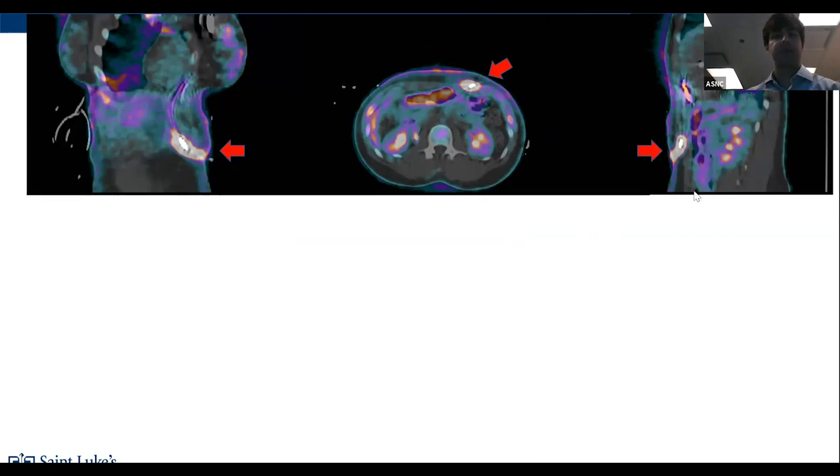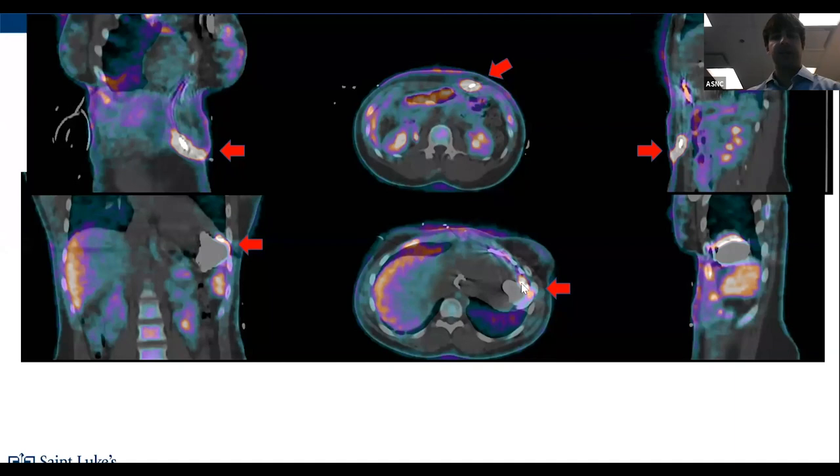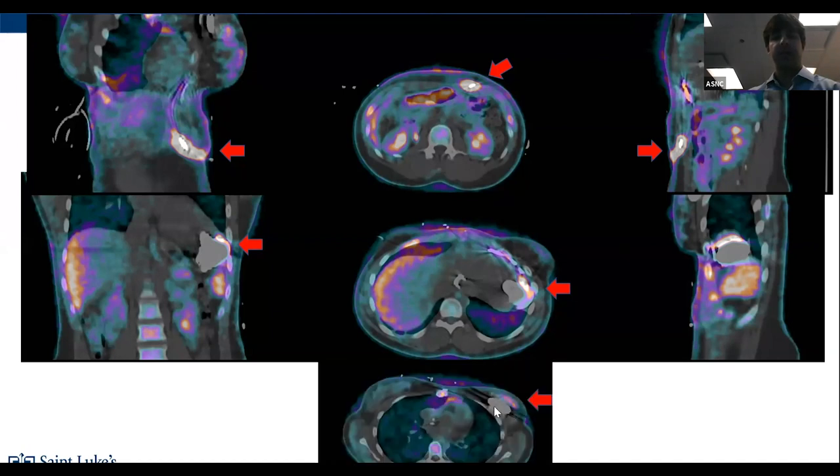with the arrows. And in the second set, you can see, again, the uncorrected images around the LVAD pump. And this is in a different area than the sutures there. So this is very concerning. And then there was a small abnormality right outside of the ICD pocket. And this wasn't a new ICD. So you're wondering as well if there's some infection going on up there in the ICD.